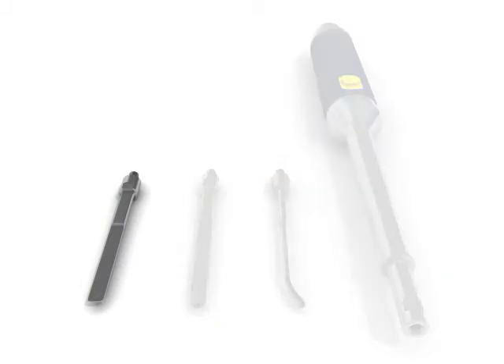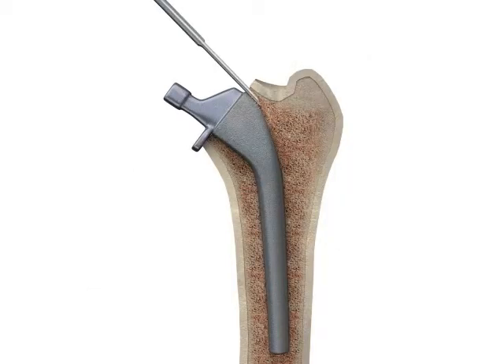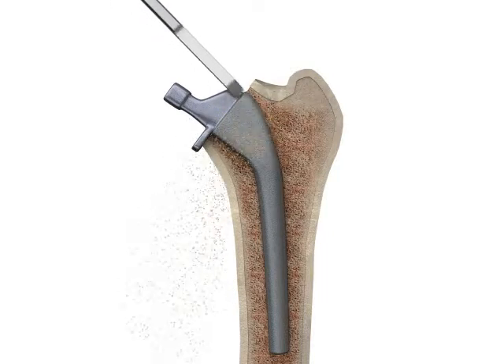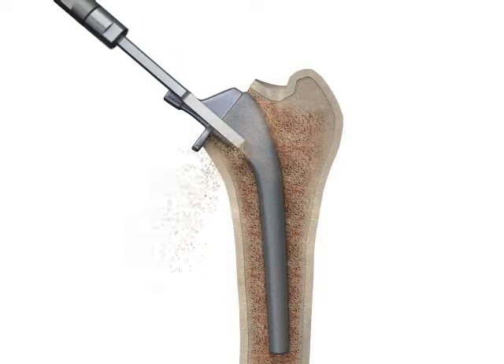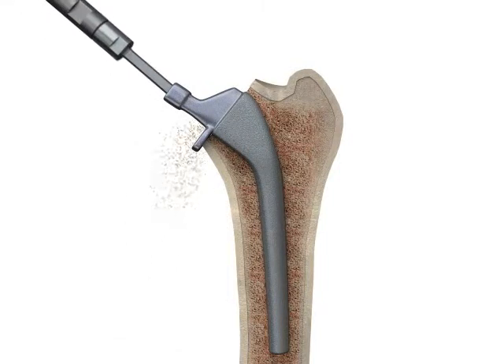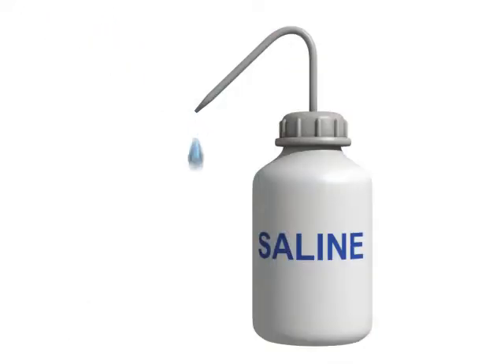The flat osteotome probes are used in the removal of proximally coated prosthetic stems. The flat 6mm osteotome probe is first used to create slots around the stem. This is done by activating and advancing the probe down the canal next to the stem. Again, it is imperative to use saline irrigation while the probe is in use.